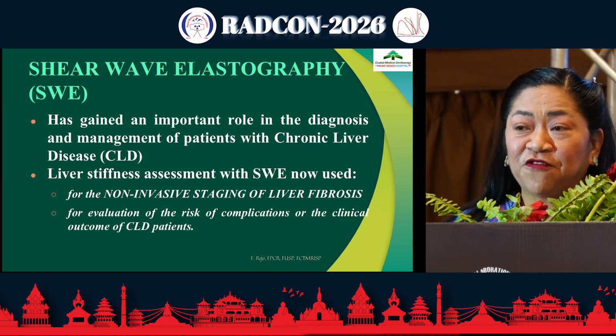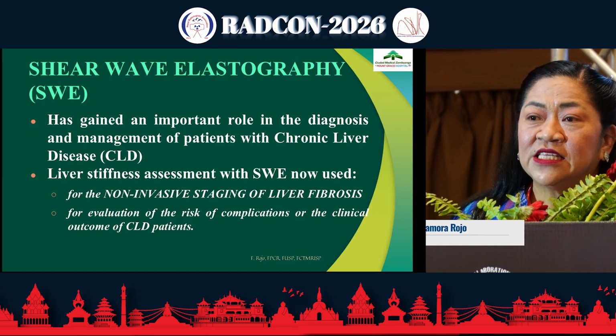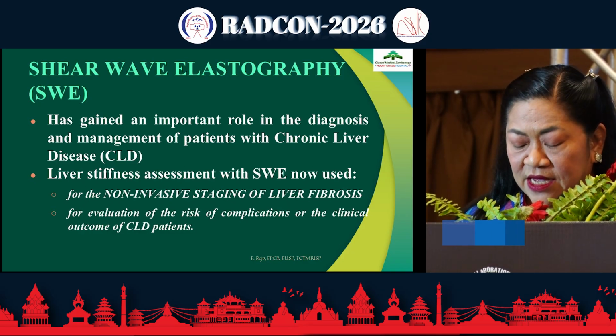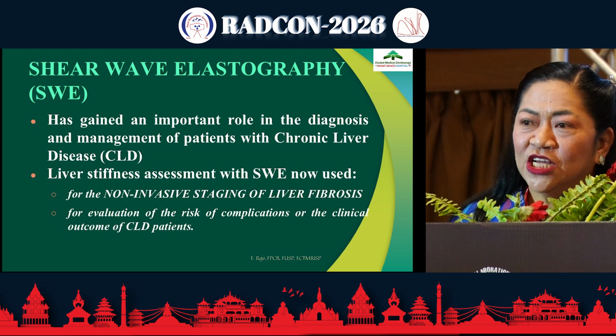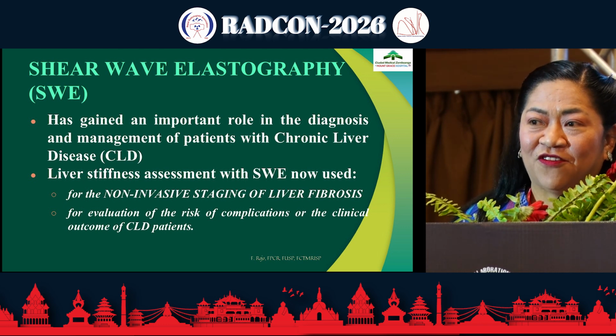Liver stiffness assessment with shear wave elastography is now used for the non-invasive staging of liver fibrosis. And it's already considered to be a mature technique for the evaluation of chronic liver disease.